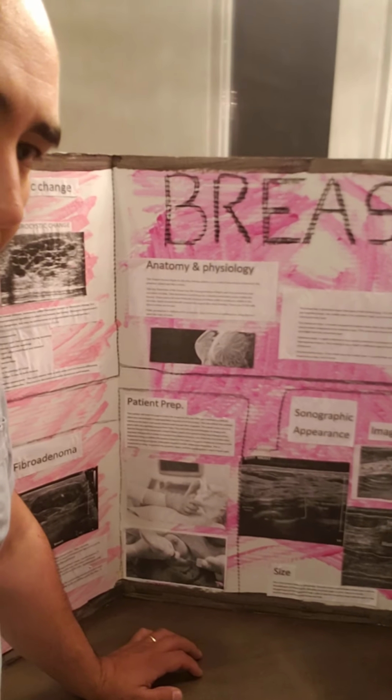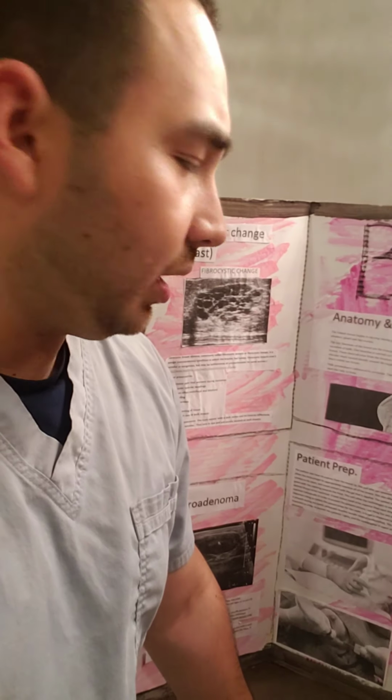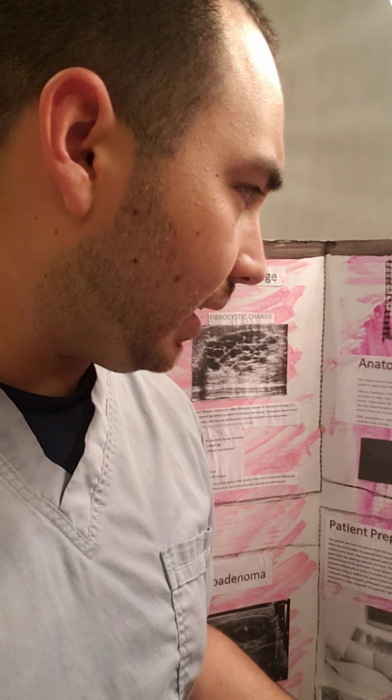There are three distinctive layers of the female breast, which are the premammary, mammary, and the retromammary layers. These are three different types of tissues located within the breast. The premammary layer is the most superficial, the most outer layer of the female breast. It's mostly composed of fatty tissue. It is hypoechoic on ultrasound, which means that it is less bright than the next tissue that we're going to talk about, which is the mammary layer right here.